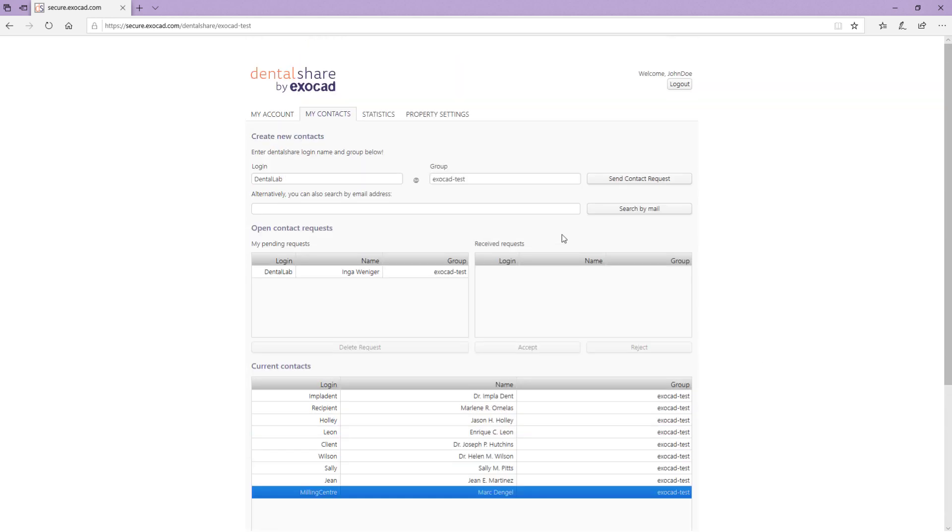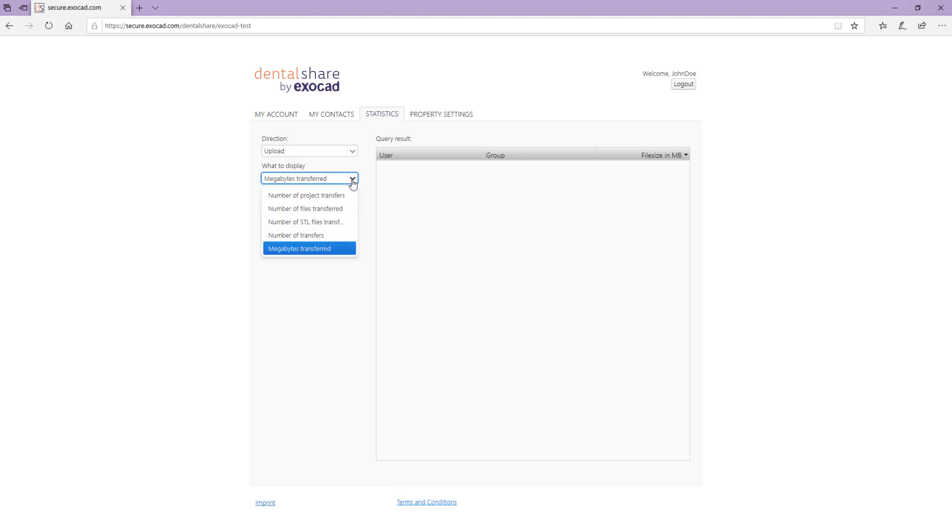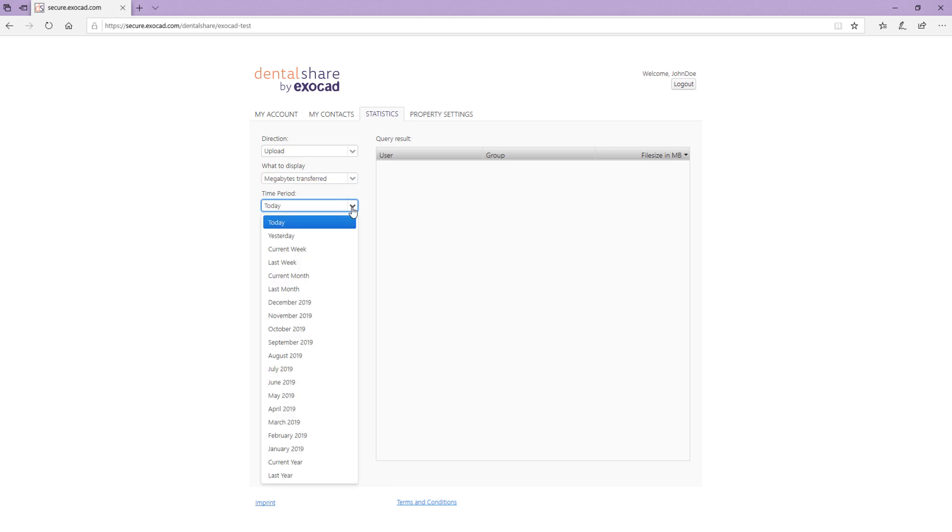In the tab Statistics, you can monitor the data transfer volume for your account. Using the drop down menus, you can select which statistics you want to display in the Query Results section in a selected time period.